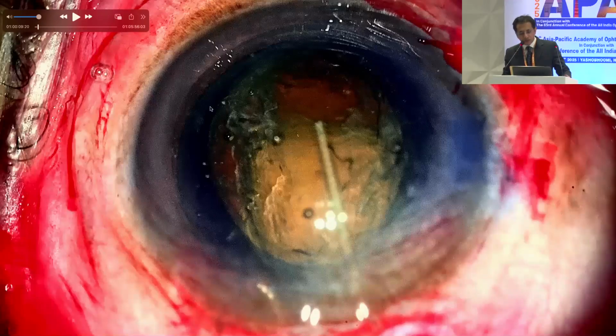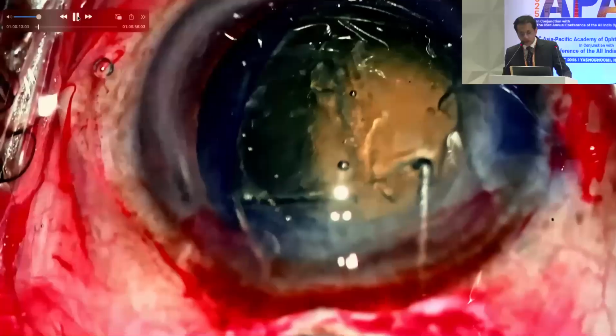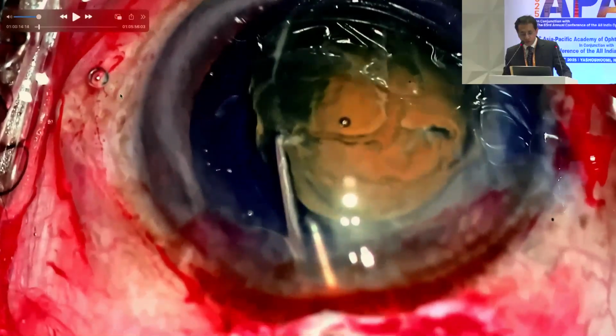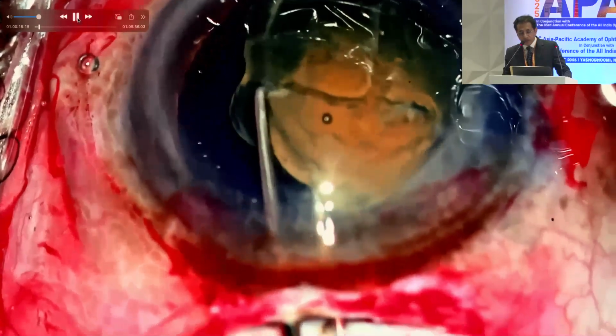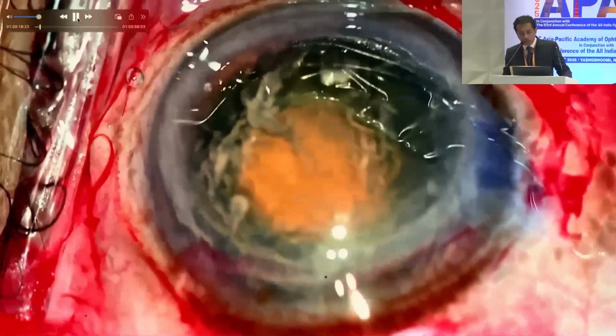Well, actually this was proposed by Dr. Kiranjit Singh for phacoemulsification, but I feel that you can very well use this for manual SICS as well. Because we have a longer exposure in the subincisional area, maneuvering the nucleus out of the bag is relatively easy. We don't do hydrodissection using 2 Sinskey hooks. It is just wheeled out of the bag.